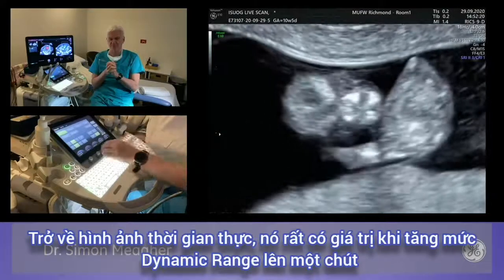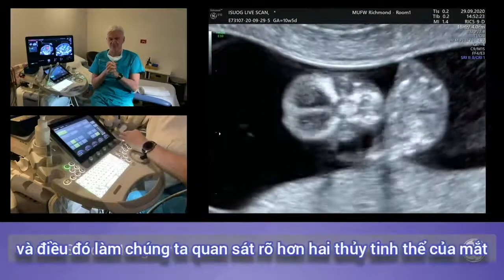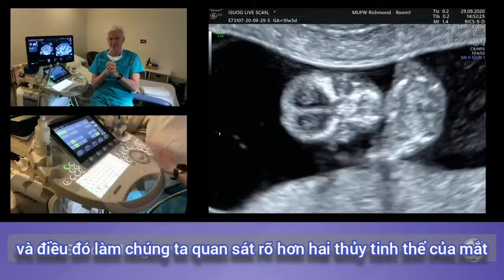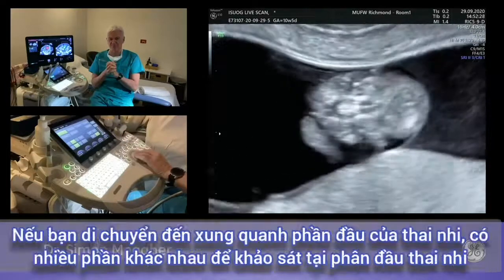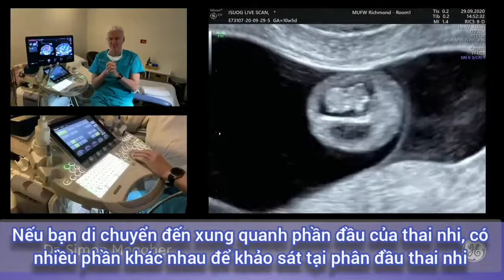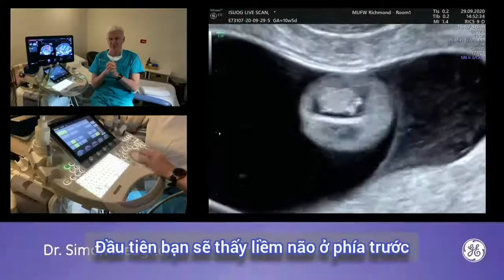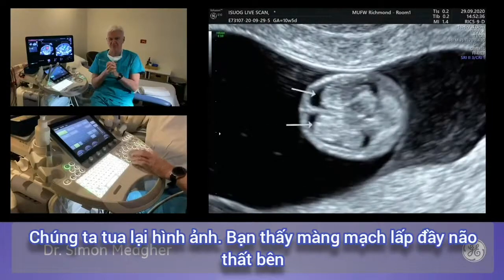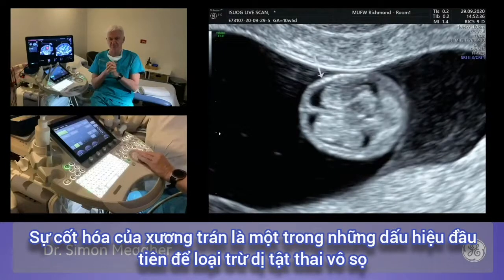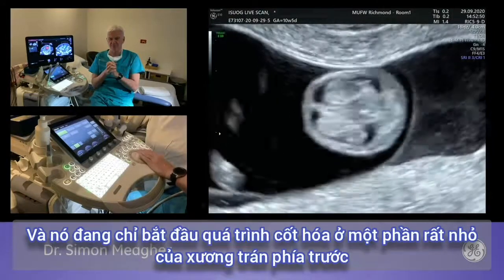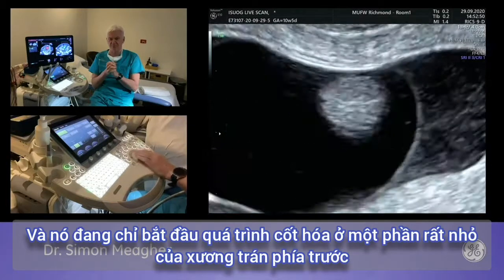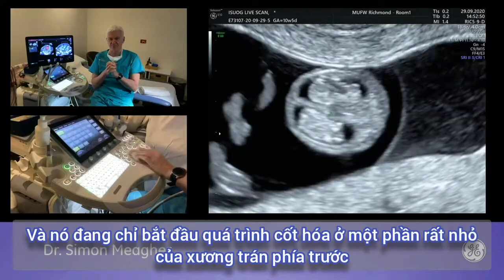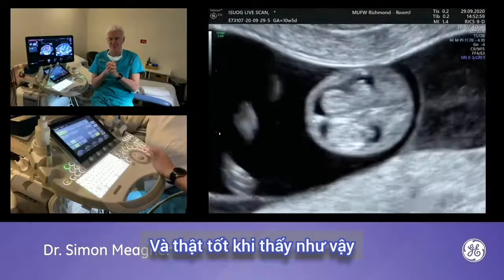Coming back to real time and slightly increasing dynamic range improves visualization of both fetal lenses. Coming around to the fetal head, the first section shows the falx extending all the way anteriorly. The choroid plexuses fill the lateral ventricles. Ossification of the frontal bone is one of the first signs, and a very useful clue in excluding acrania — it begins to ossify on a very small proportion of the frontal bone anteriorly. Coming down from that, you see the third ventricle.